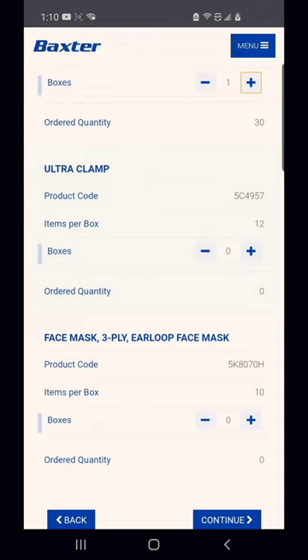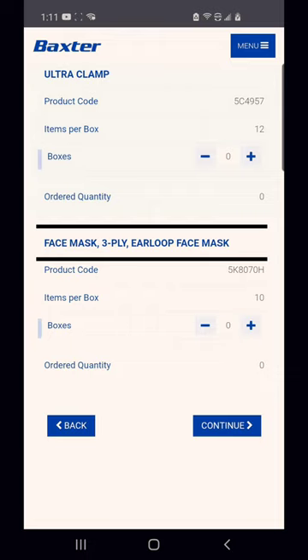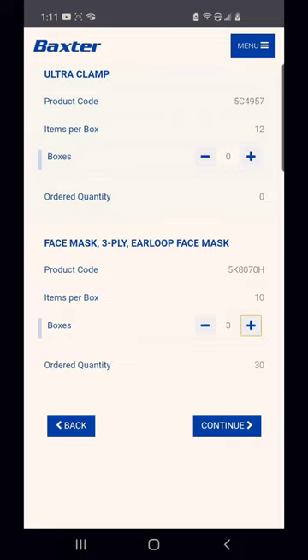And I'll probably show you guys later how I use the clamps for my current machine. You usually won't need to reorder these unless for some reason you're throwing them away instead of washing them. So there's that. And then the face masks. They come in packs of 10 and you're supposed to use one per night. So I'm gonna order 3 boxes, so it's one per day. And then I'm gonna click continue.